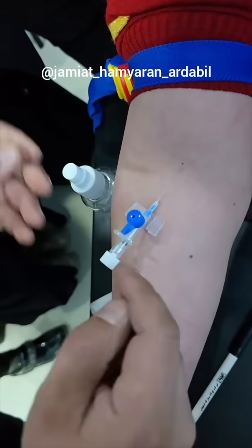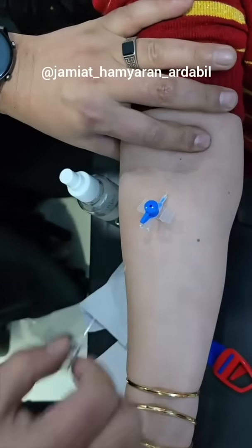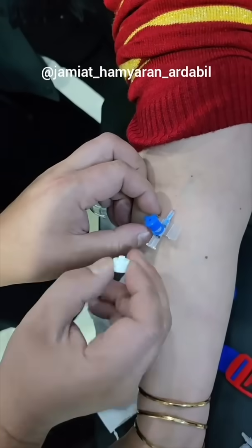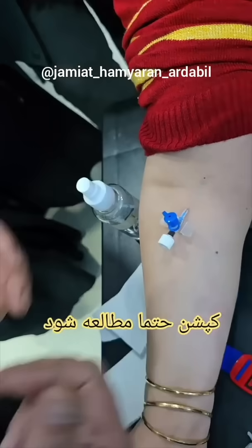You can see he got flashback only after the needle was completely inserted, which means only a small portion of that catheter is likely in the vein. Because he inserted so far away from the vein instead of right on top of it, that's likely the primary reason he missed the first attempt. Oh, and just a tip — maybe wear some gloves if you can.